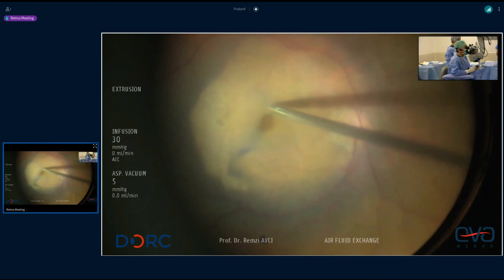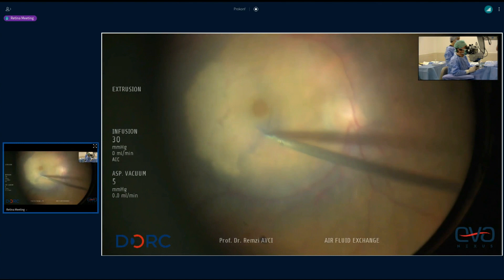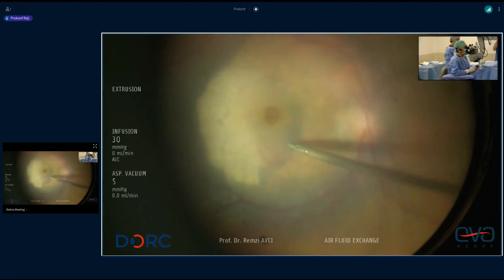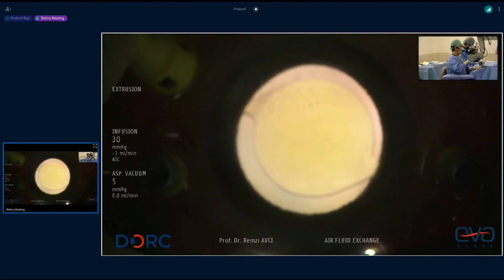You could send some of this ILM also to Dr. Rizzo — he can put it on top of the amnion. You have so much ILM here. As you know, we already peeled the temporal ILM and inverted it over the macular hole area. Surgery is already finished. Remzi, I recall you saying in a previous meeting that you like to use perfluorochemical to push the ILM — but you're not using it here? Yes, I will use it again, Don.